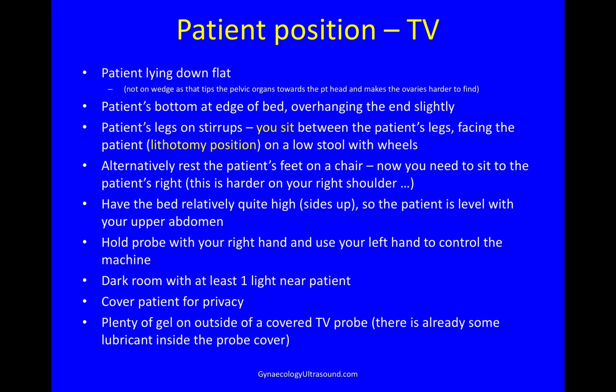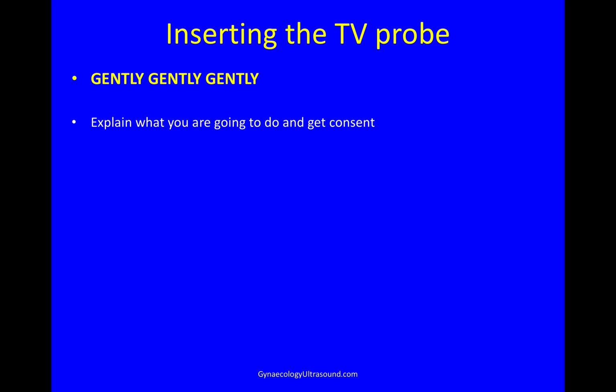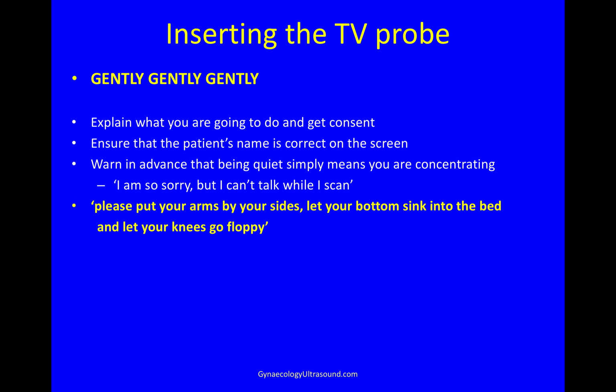You don't need to put extra on the inside or on the outside, just plenty of gel. And then gently, gently, gently is the main thing I'm going to say about this. Explain what you're going to do and make sure your patient is consenting to it. Make sure her name is correct on the screen. Warn patients in advance that if you're quiet, it just means you're concentrating. And what I always say is, I'm so sorry, but I can't talk while I scan, because I literally can only do one thing at a time.